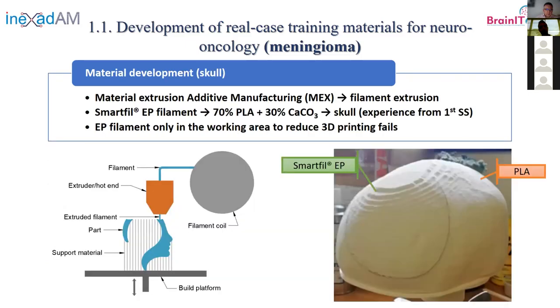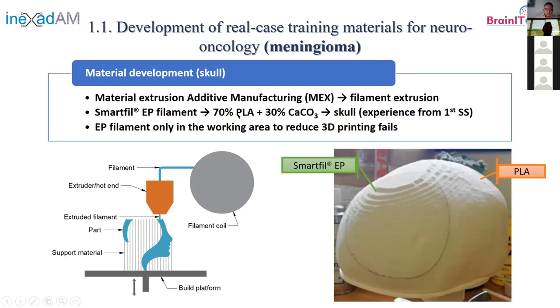To do that, the first thing we did was assess different materials for the manufacturing of the skull. We focused on material extrusion additive manufacturing. From the previous summer school, we selected the Smart Fill EP filament — a PLA filament with some calcium carbonate. According to previous tests, this material was more similar to real bone than standard PLA, so the cutting forces were more similar.